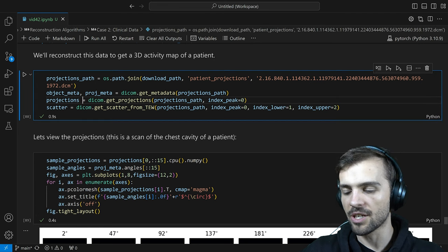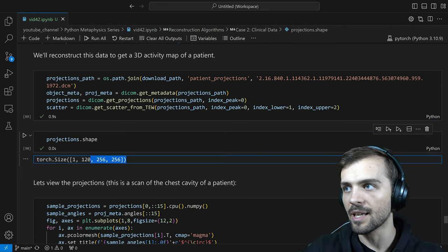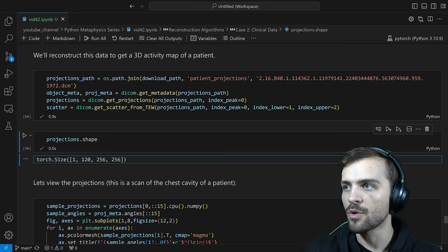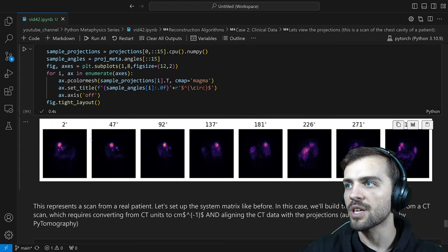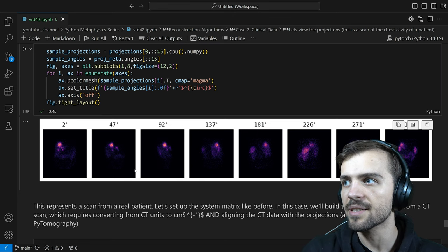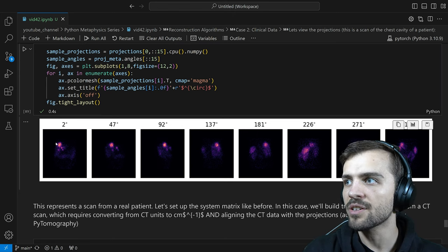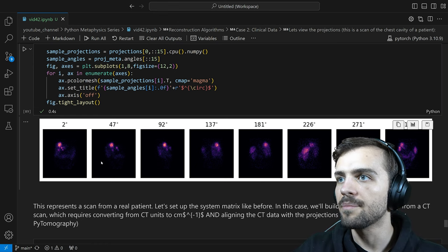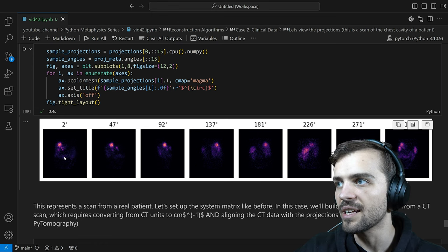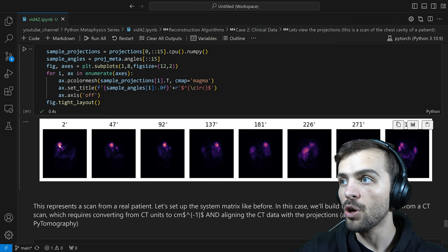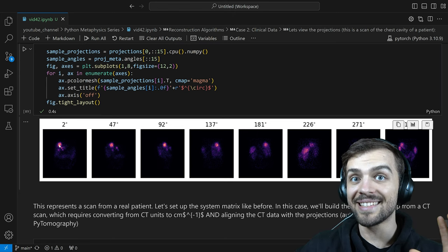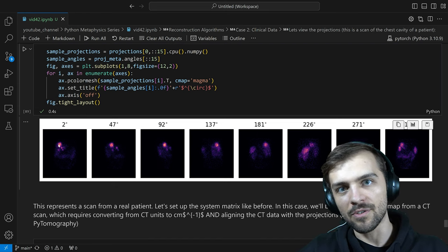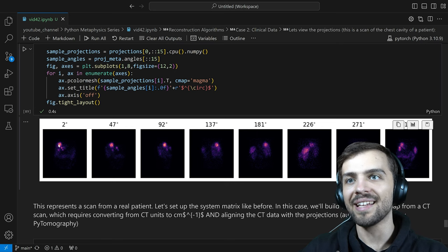We can view the projections like before. The projections array has a slightly larger 256 by 256 matrix size — this is actually a high-resolution SPECT image — at 120 different projections. Looking at the projection data, that light purple triangular region is the patient's liver — we're looking at the center of their body. You can also see a kidney and some activity elsewhere. That bright glow in the liver is a tumor. This is why SPECT is so useful: this bright glowing object represents the radioactive molecule binding to the tumor at that location, and it lights up on the SPECT scan.